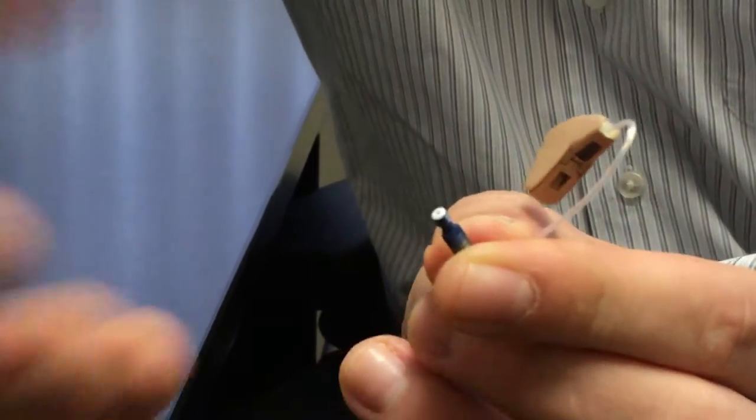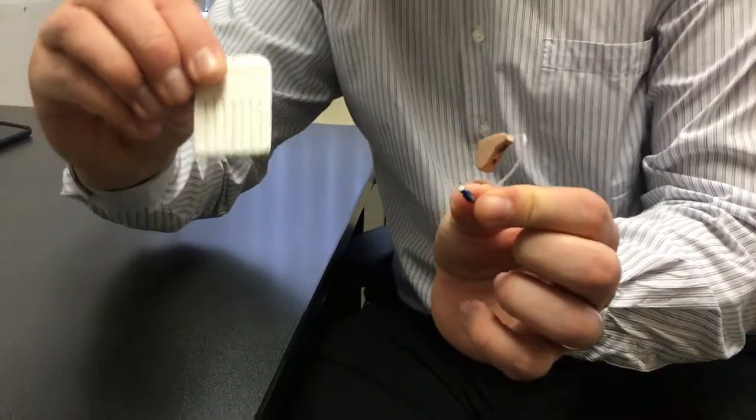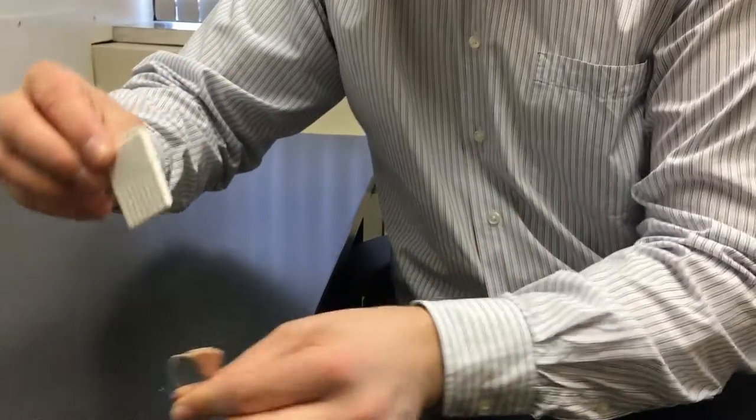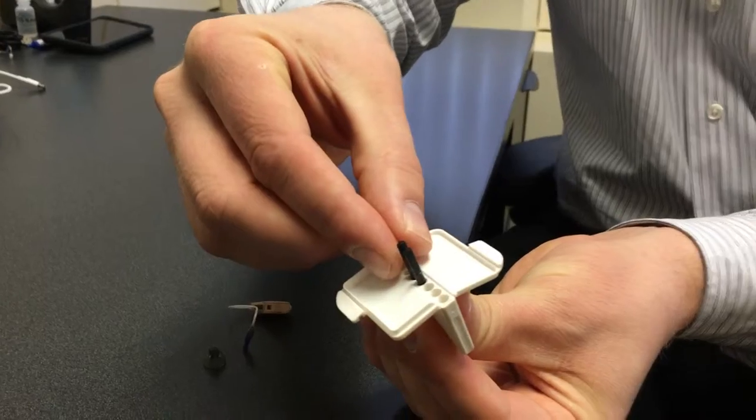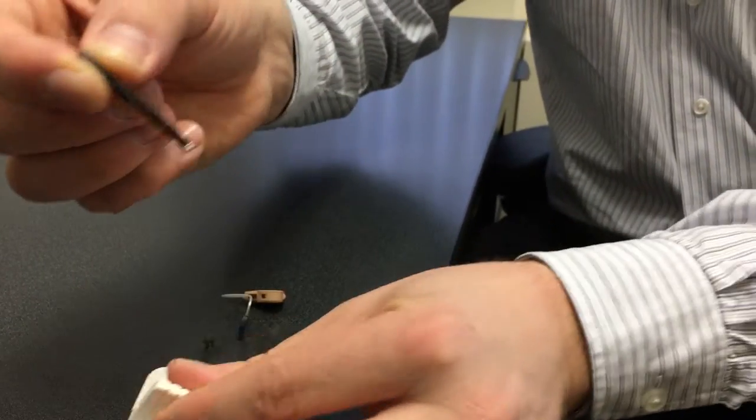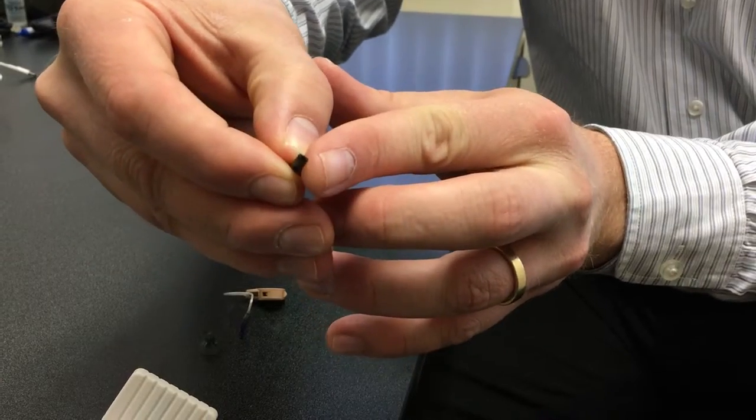So eventually it just needs to be changed and it's very simple. There are some extra wax guards, you should have some in your kit. Simply open up the case like so. Inside are some fresh filters. It's a little stick. On one end is the fresh filter, on the other end is the removal tool.